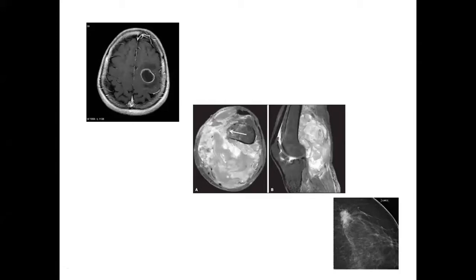So if you start mentioning cell types when you're talking about radiology, you are guessing. Equally, if you're talking about certain bugs, very specific bugs like streptococci, again, you'll be guessing, because only the microbiologists can tell us that diagnosis.